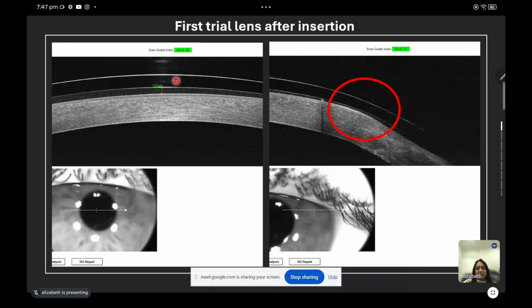All right. So if you're using a slit lamp, you would basically just use your slit beam. You do an optic section, and you would compare the tear thickness to the lens thickness. These lenses are about 200 microns, 200 to 300 microns. Again, you'd have to check with your manufacturer what the thickness of their lenses are, and then you can compare your tear thickness to the lens thickness.